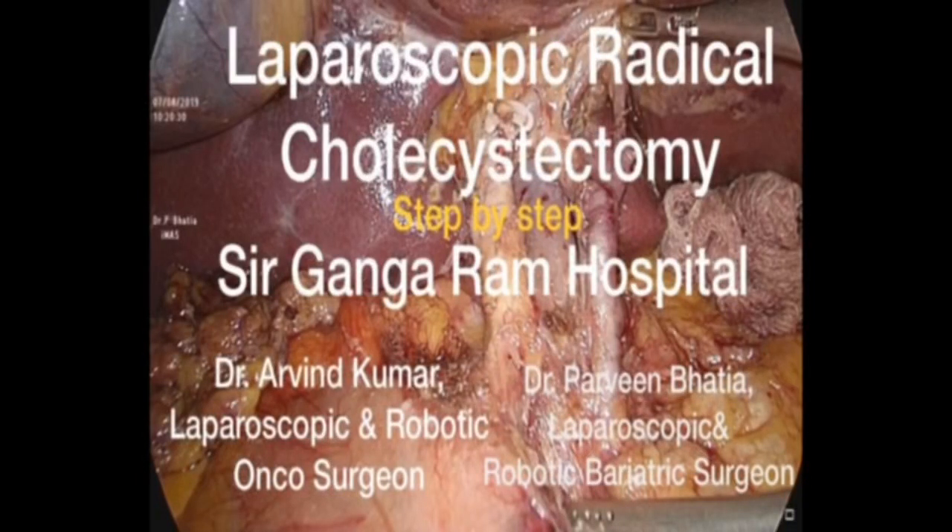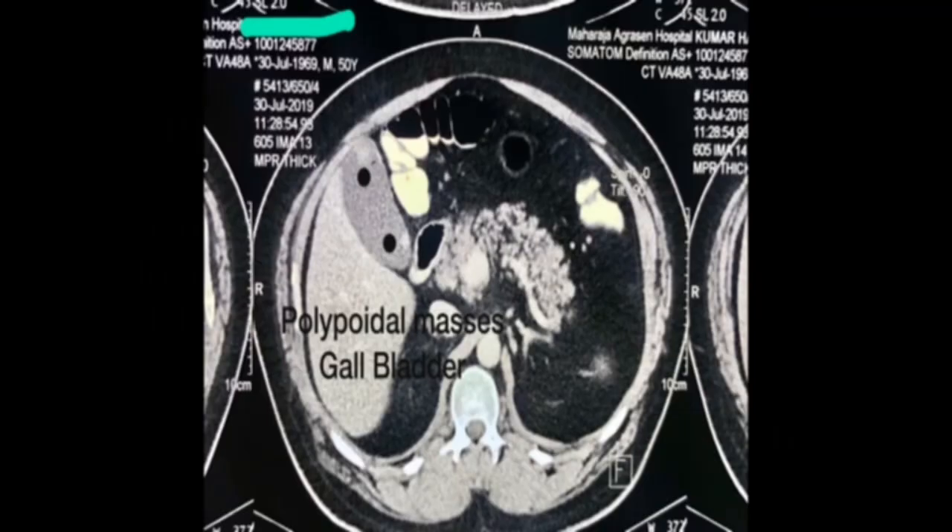Laparoscopic Radical Cholecystectomy for Carcinoma Gallbladder: Step-by-Step Approach. We present a 48-year-old male who had a polypoidal mass in the fundus and infundibulum.